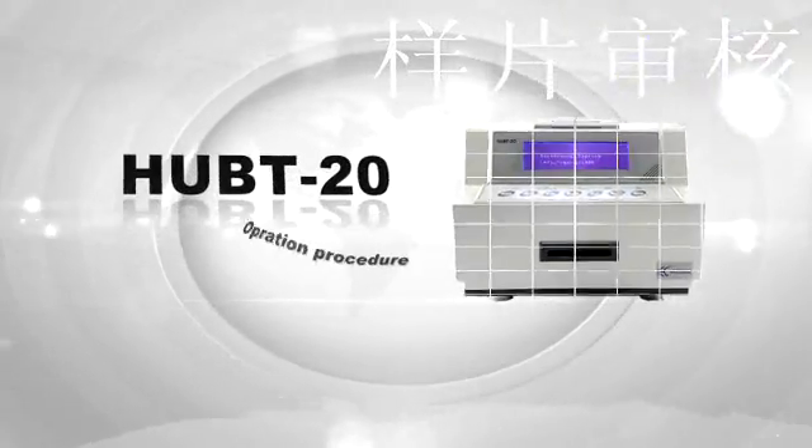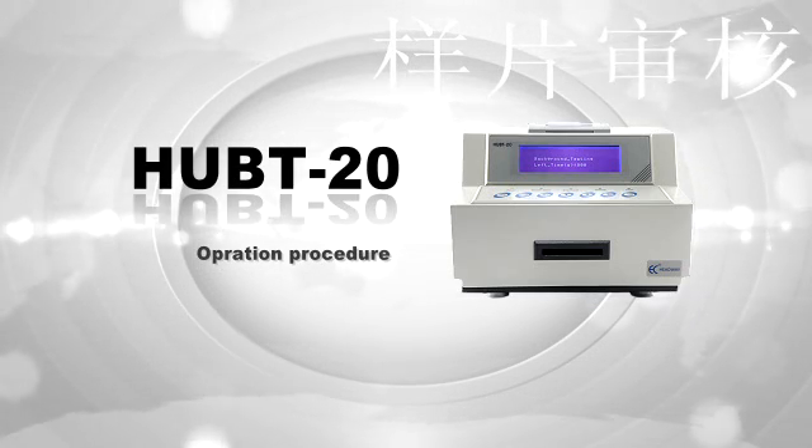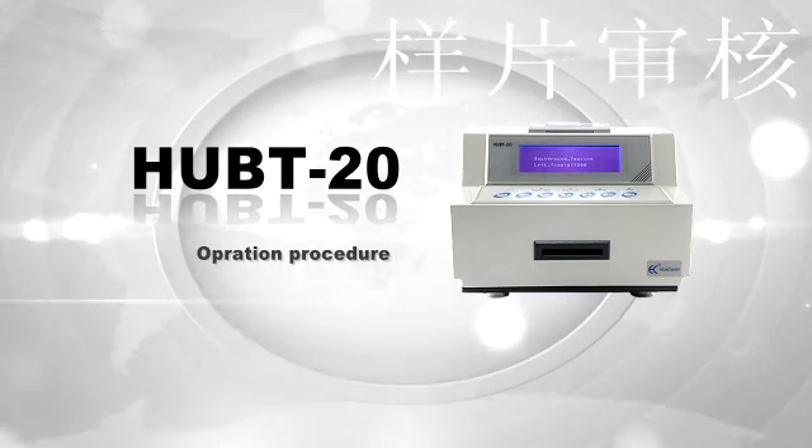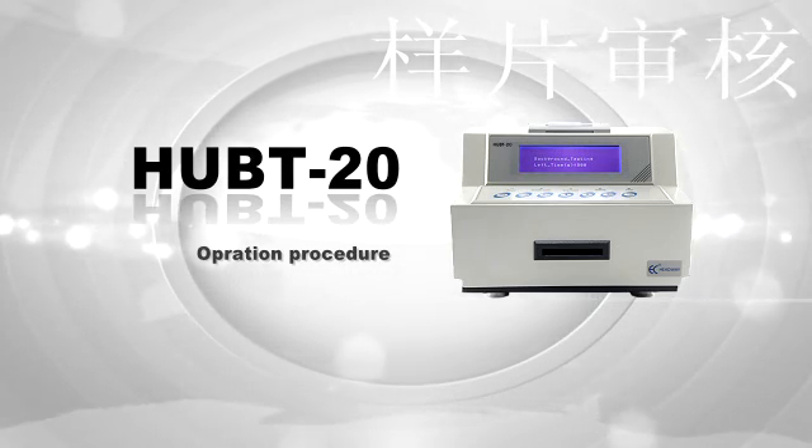Thank you for using Hedwig's HUBT20 Helicobacter pylori detector. In this video, we will introduce the functions and show you how to operate and calibrate it.